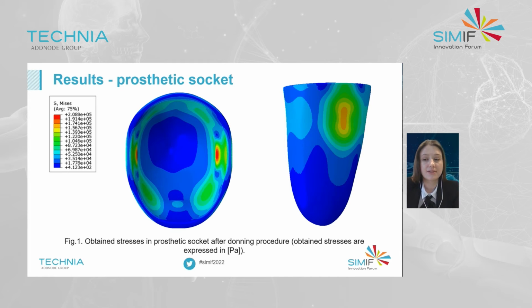The conducted analysis enables us, first of all, to assess the stress state in the prosthetic socket. The highest value of stresses was observed on the surface which penetrates the residuum in order to provide a press-fit condition, and the highest value of obtained stress was equal to 0.2 megapascals.